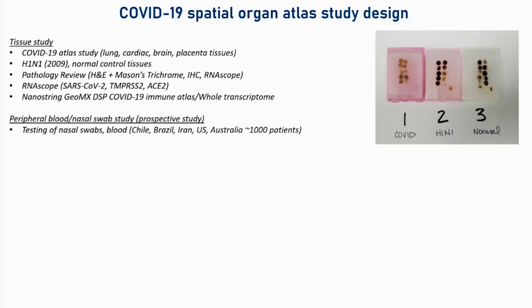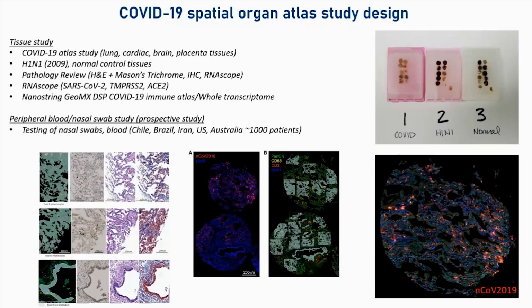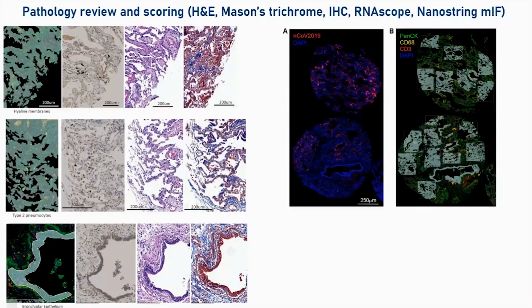We took the tissue-based findings, and then in a pre-Omicron study, we looked at those genes in the blood and nasal swabs in about 1,000 patients in a cross-sectional multi-cohort study, again, pre-Omicron, where it wasn't rampant across the world. And so we could localize the virus in the tissues using RNAscope. This is a depiction of it on the bottom right. The areas in red are tagging where the viral infections are in the lungs. And so we could identify regions within the tissue that we wanted to profile based on that.